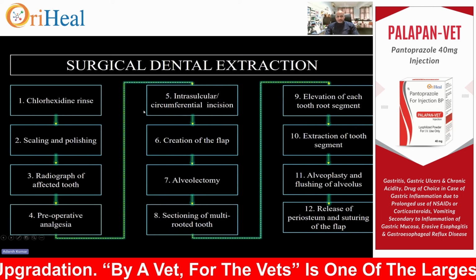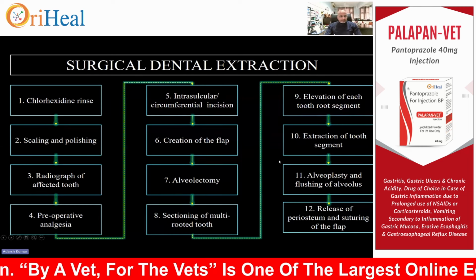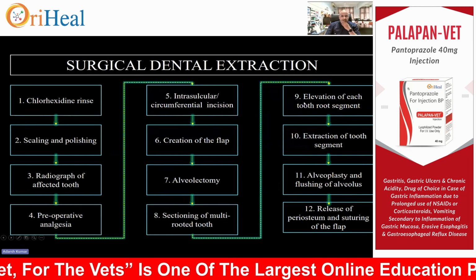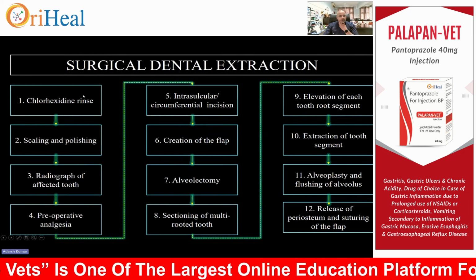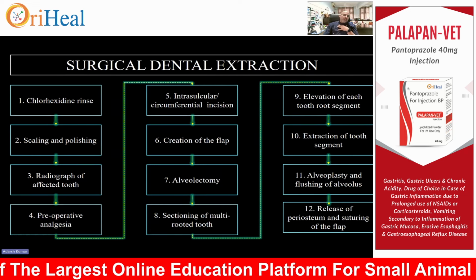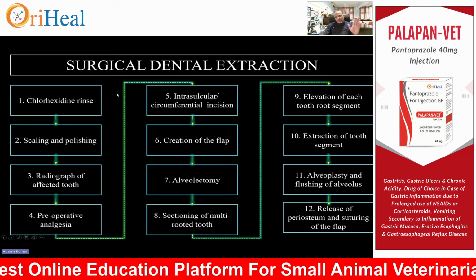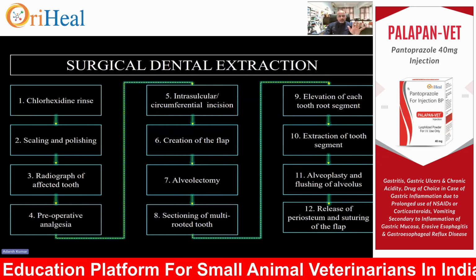So next is the surgical dental extraction. Whenever you do a surgical dental extraction, don't get scared with that much of a table. I'll just make it very simple for you. The first and foremost thing is give a chlorhexidine rinse to the mouth, right? And remove everything within the mouth, give a chlorhexidine rinse, wait for 5 to 6 minutes, let the chlorhexidine act within the mouth.